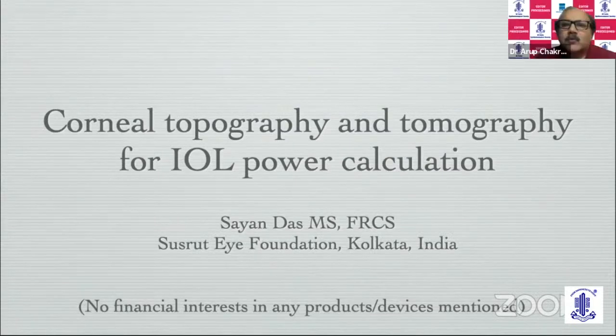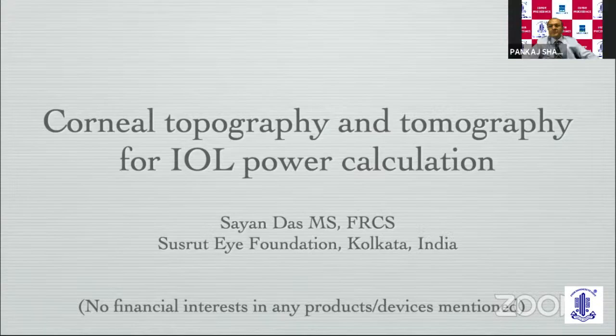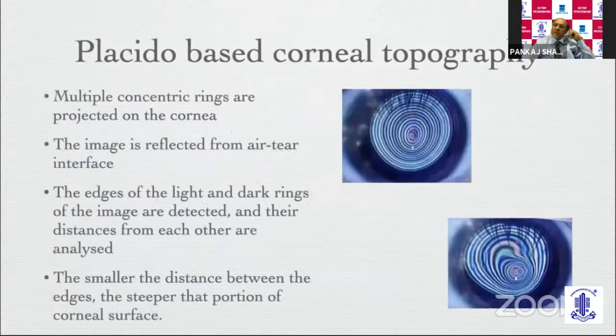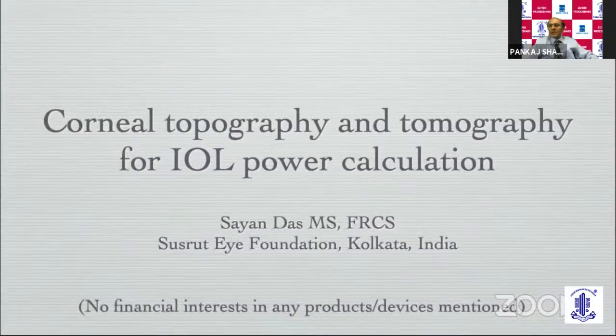Dr. Pankaj, what would be your approach? Actually, topography would help mostly, but here we use Scheimpflug imaging also, because that will also give the posterior corneal irregularities in these cases. So we might have a better understanding of the cornea.